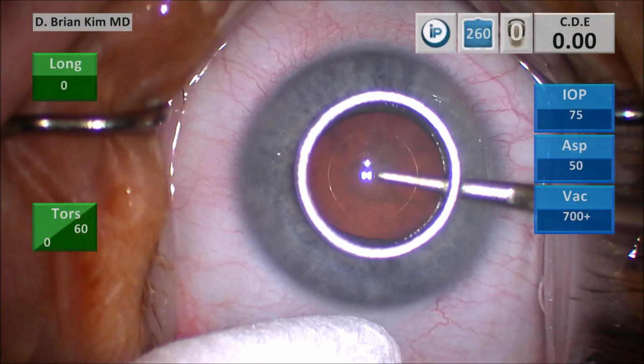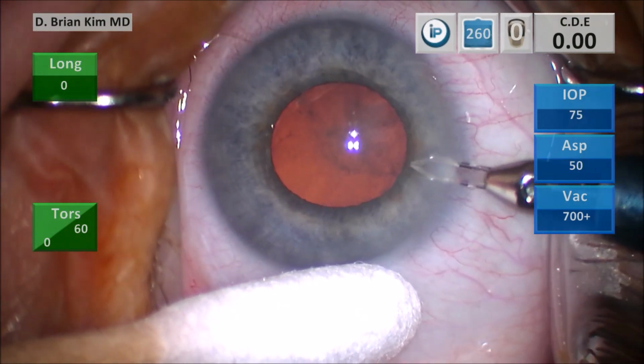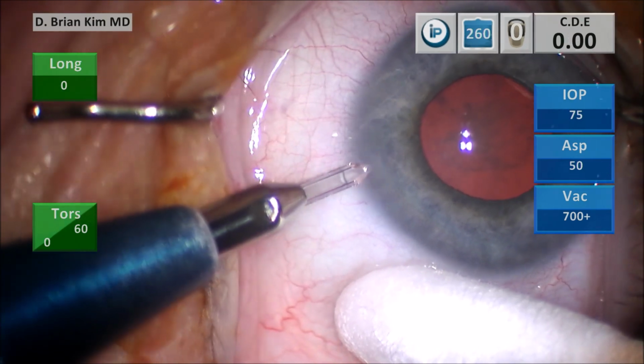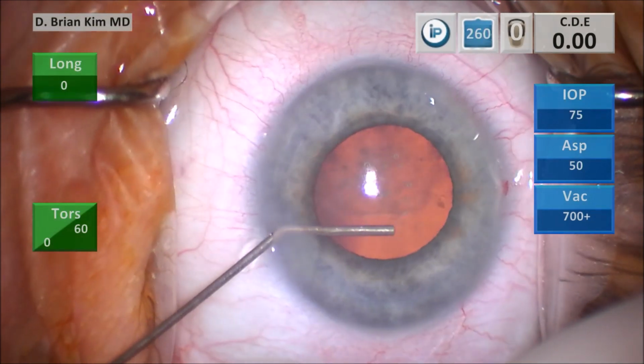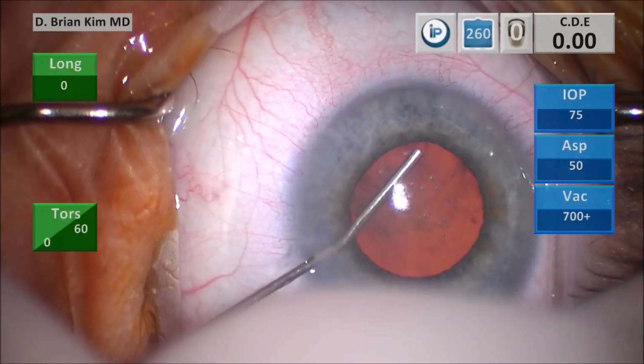I use a corneal marker to help me center and size my rhexis. And then I make my paracentesis incisions, making sure I'm flat to the iris plane to have a nice self-sealing incision. I'm injecting intracameral lidocaine and then intracameral epinephrine. I'm going on the surface of the iris as well as underneath the iris.